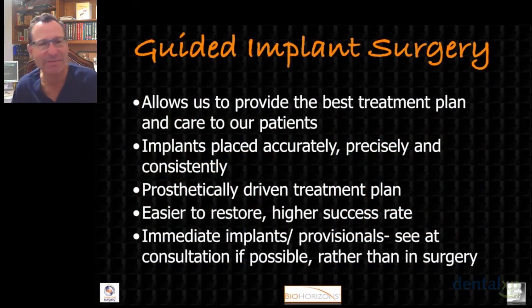So guided implant surgery really allows us to provide our patients with the best treatment plan that we possibly can, because we're placing our implants accurately, precisely, and more importantly, consistently. That guide makes sure the implants go where they need to be every time, or let's say 99.9% of the time. Also, we're doing our treatment planning completely prosthetically driven.